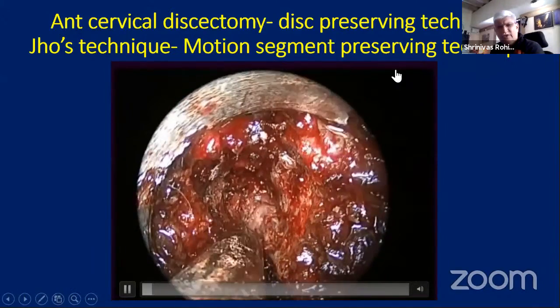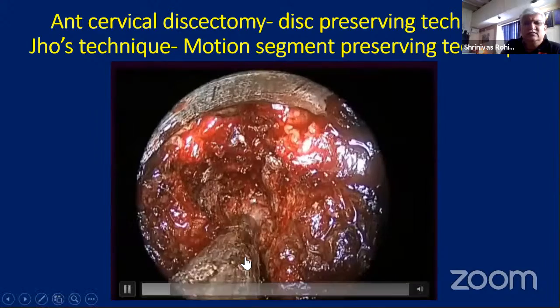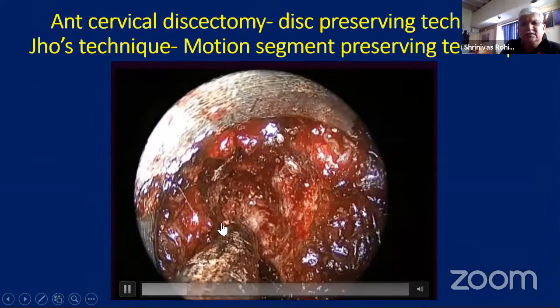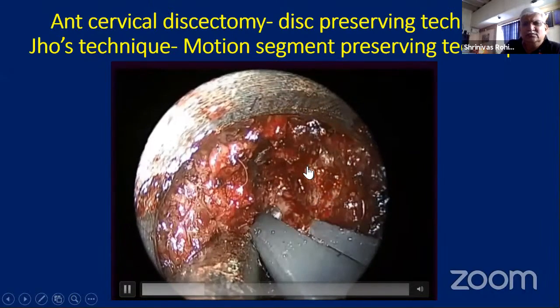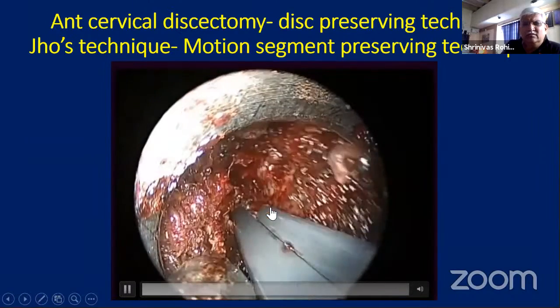Now this is the thing which I just wanted to share. The Destandau, we can use it for each and every pathology. This is anterior cervical. This is the vertebral artery. This is the suction, and the foraminotomy is around 8 millimeter. This is around 10 millimeter.